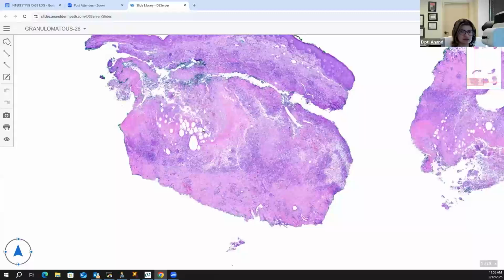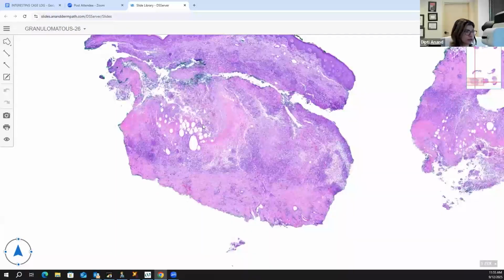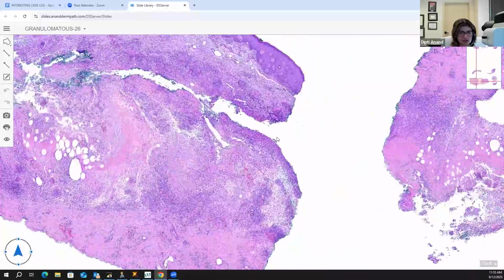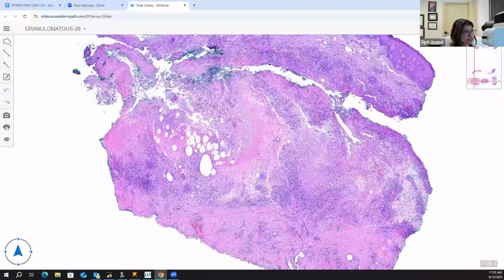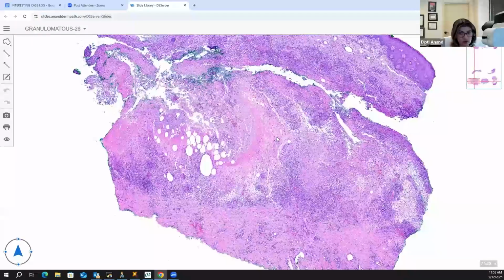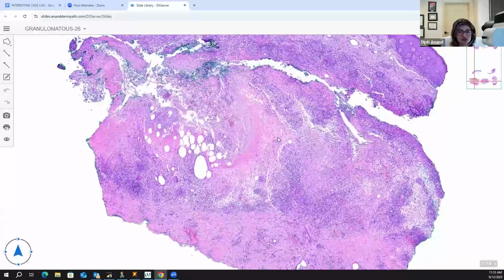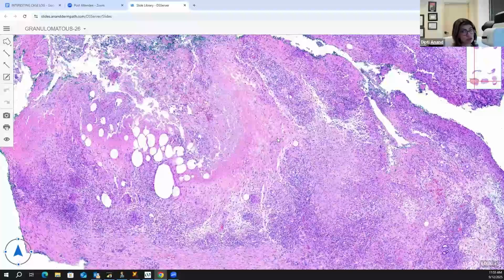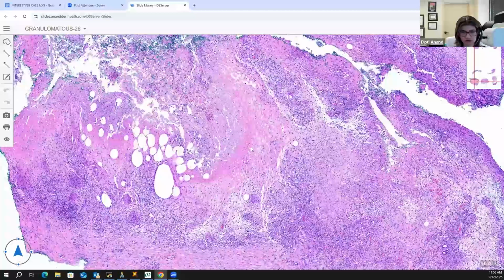is pseudopalisaded. That's a beautiful word. That's a word of a dermatopathologist that you use. So that's really nice. Does everybody get that appearance? What Arman described, it's pseudopalisaded. It's not palisaded truly, right? Because if you think it's palisaded truly, then you start thinking about GA, NLD, and rheumatoid nodule, and you go down the wrong path. So it's a pseudopalisaded infiltrate.